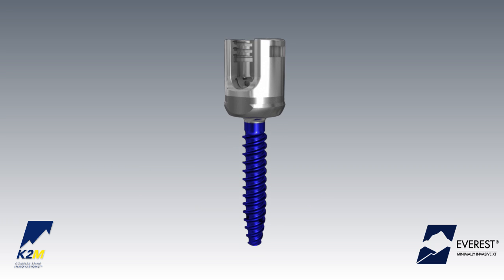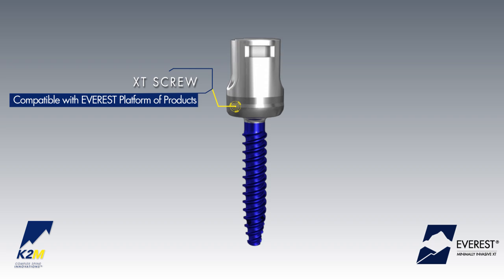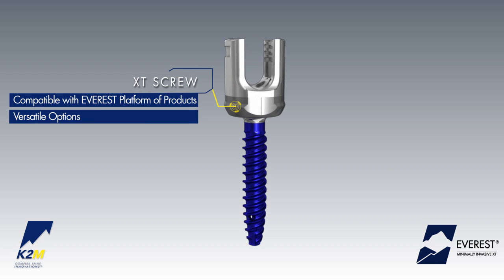Upon removal of the extension tabs, the XT screw is compatible with all Everest system instrumentation, providing a versatile option for users.